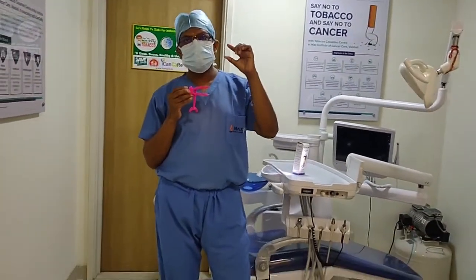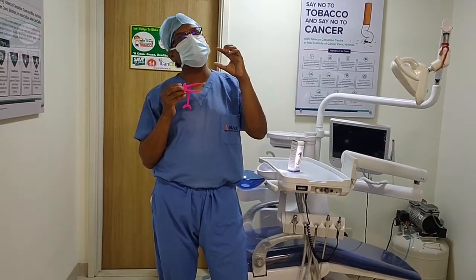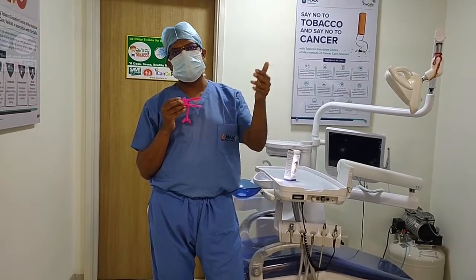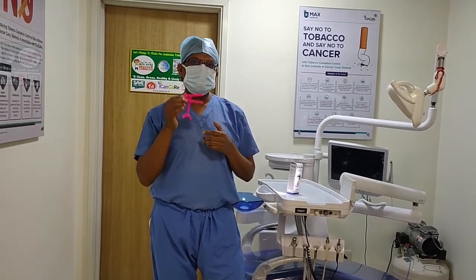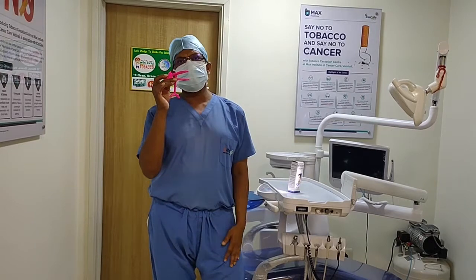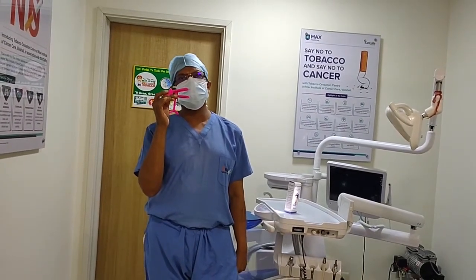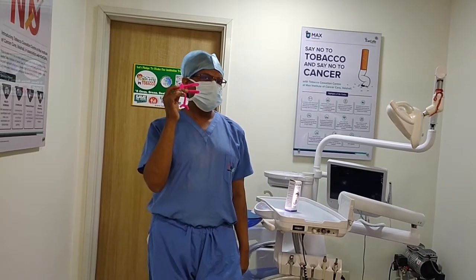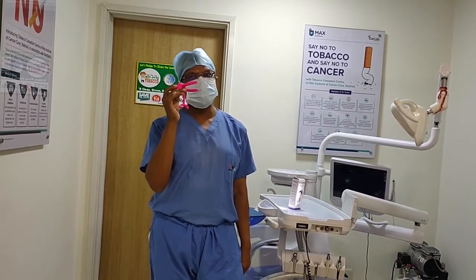Every person using this device can know for themselves exactly how much their mouth is open. We have to use it in our mouth — this is a wonderful device called Triscare. Our patients who are asked to do exercises should use it in the morning regularly. You have to use it regularly; skipping is not good.